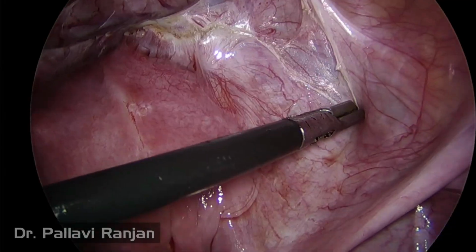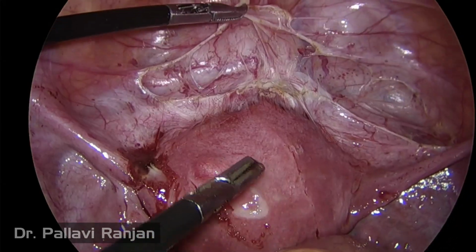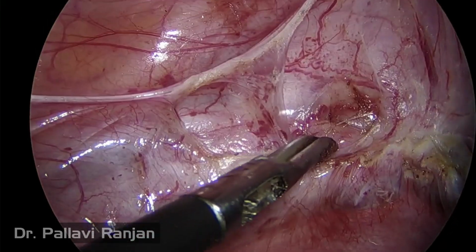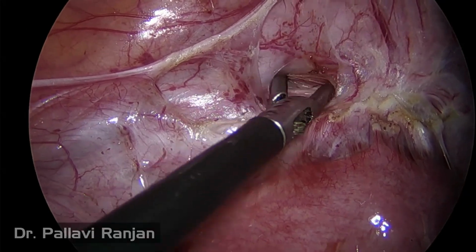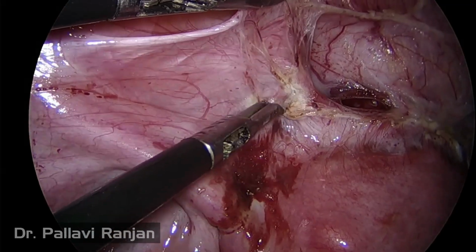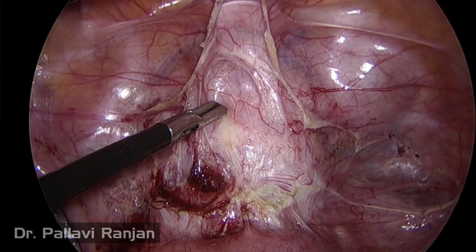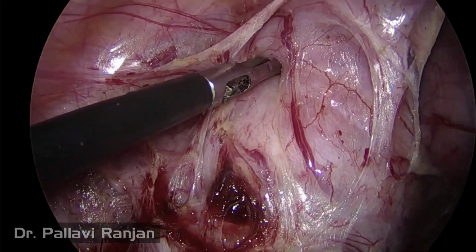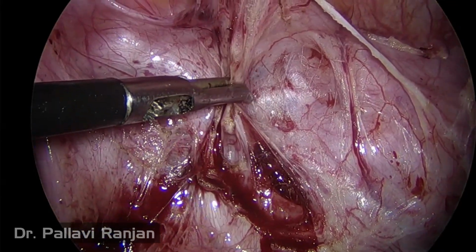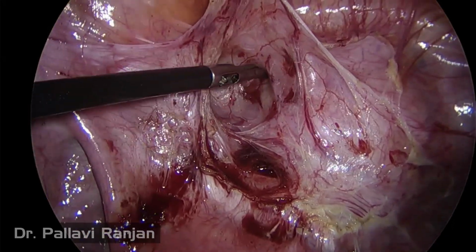After separating the peritoneum, we are now trying to separate the bladder fibers over the lower uterine segment and the scar site. But as you can see, normally they can be adherent. So to ease the separation of the bladder over the lower uterine segment, what we do is we insert a vaginal tube. Normally in a pregnant uterus we cannot insert a uterine manipulator, so we are going ahead with a vaginal tube. Vaginal tube basically helps with ease of plane dissection and helps in pushing the uterus cephalad, which indirectly stretches out the fibers and helps in bladder dissection.